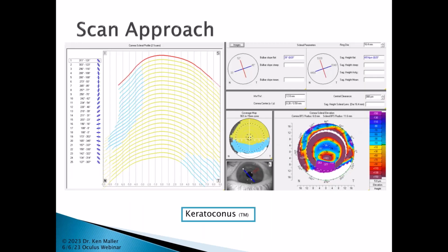Now here, we're starting to see on this keratoconic eye that the capture is certainly not as clean looking as the previous ones that I've just shown you. You can see here I did a double capture. The golden one captured the center and superior portions, but not entirely. And then the second one captured the inferior, but despite that, I'm still missing an enormous amount of data down there.